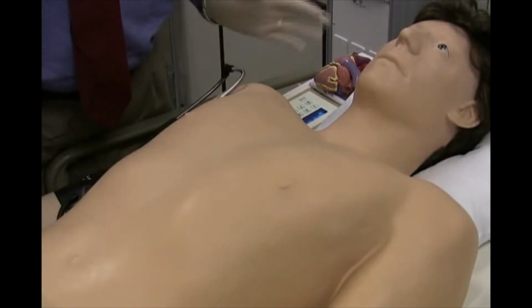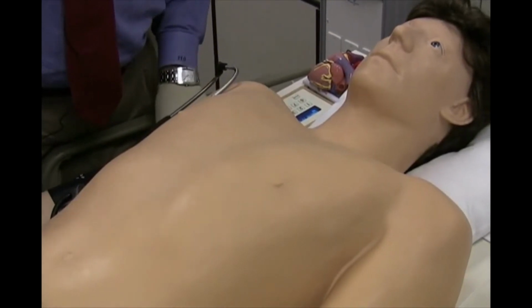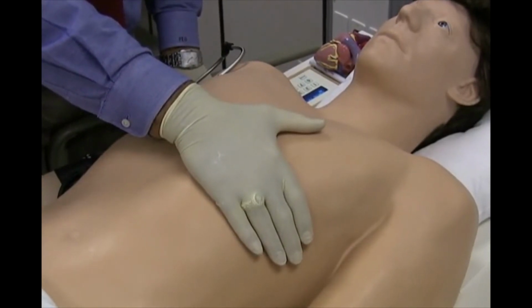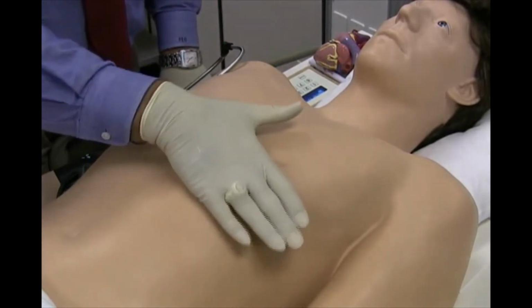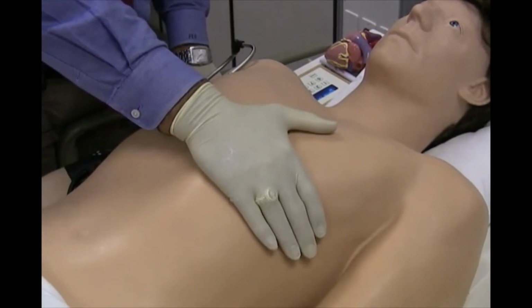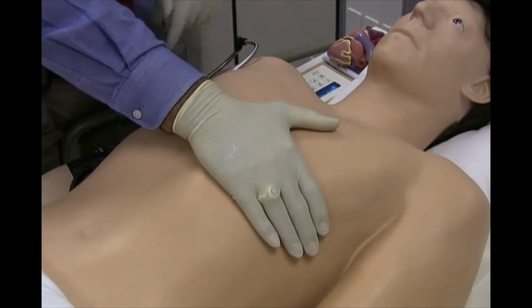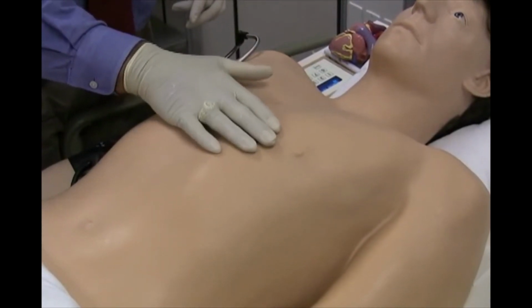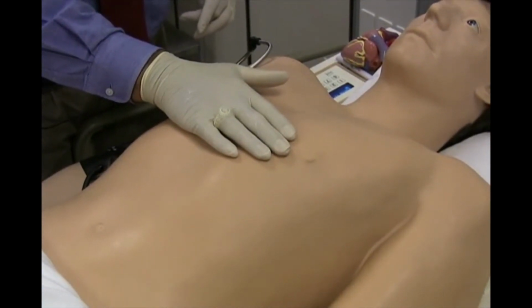Okay, so when you're examining the heart or examining the patient, you always do it from the right side of the patient. And the first thing you do is you put your hand over here to the side, because sometimes patients will have their PMI way out here in the anterior axillary line or the mid-axillary line, and so you have to start there with your hand, and I put my whole hand down on the chest, almost like you were doing a push-up. Make sure you use the whole surface area of your hand to feel something. Now I can feel the PMI right now under this part of my hand, so I'm going to pull back, and the PMI is right here. I think you can almost see my middle finger bobbing up and down there.